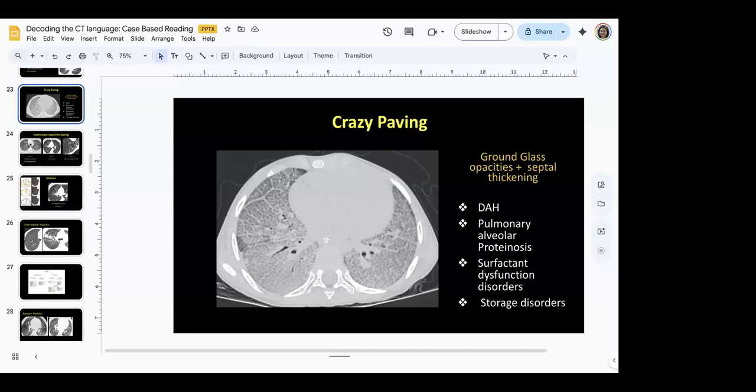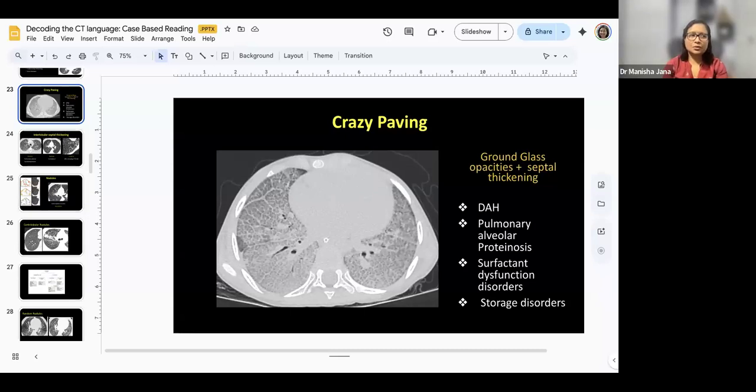Okay. The last two questions from my side. One is, we sometimes see virtual bronchoscopy in the CT scan. Any utility of this virtual bronchoscopy? Yeah, virtual bronchoscopy is useful to show what I am seeing, to show it in a better way to you.